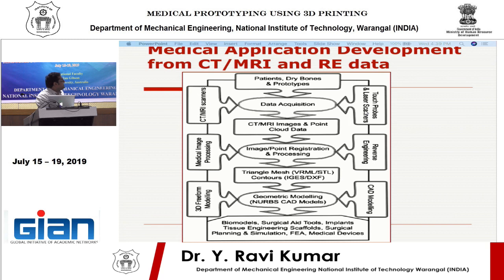And then if it is a CT, you will get images. It's a number of grayscale images which you are going to get. If you take a skull, it may be around 300 or 400, but again it depends on what the slice thickness is and what the slice interval is, which are used in a CT scanner. So it depends. Basically, those are the images.